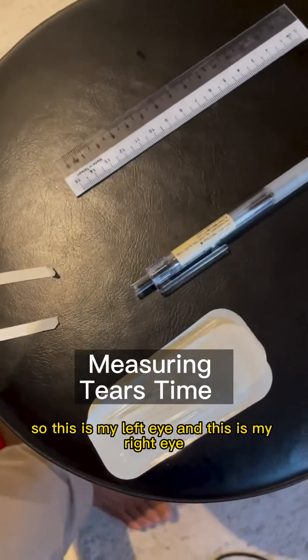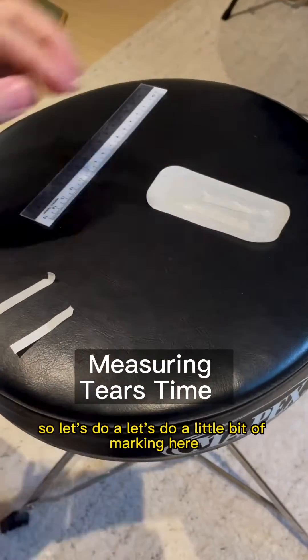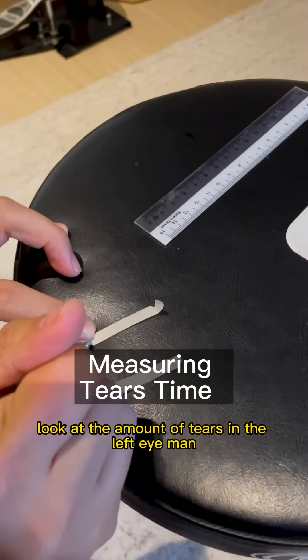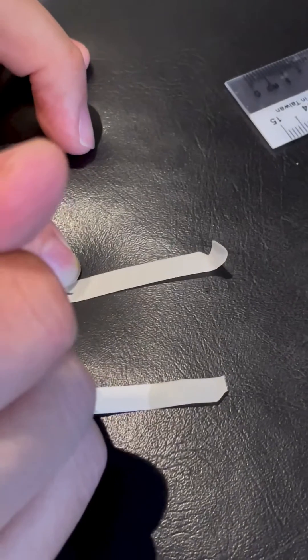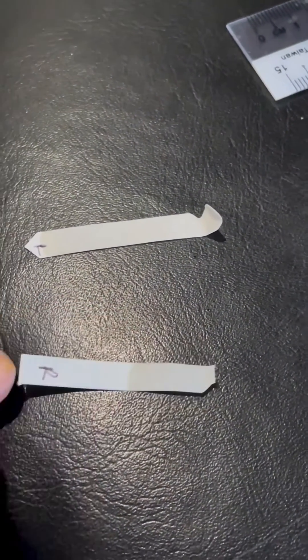So this is my left eye and this is my right eye. Let's do a little bit of marking here — this is the left eye. Look at the amount of tears in the left eye, man! Look at this! And this is right.